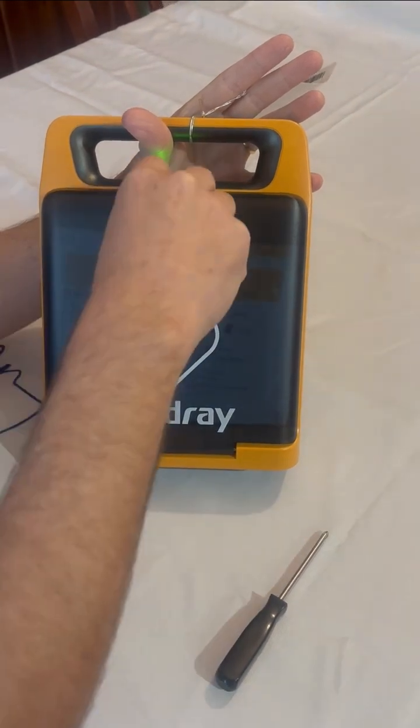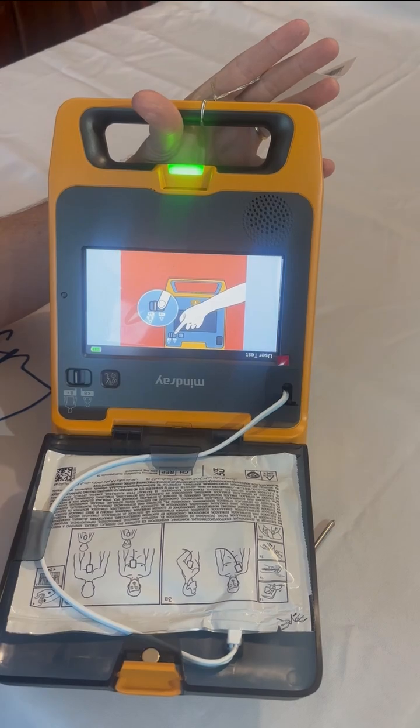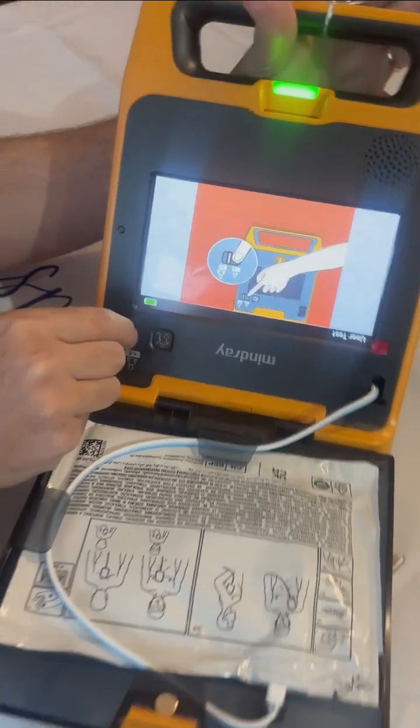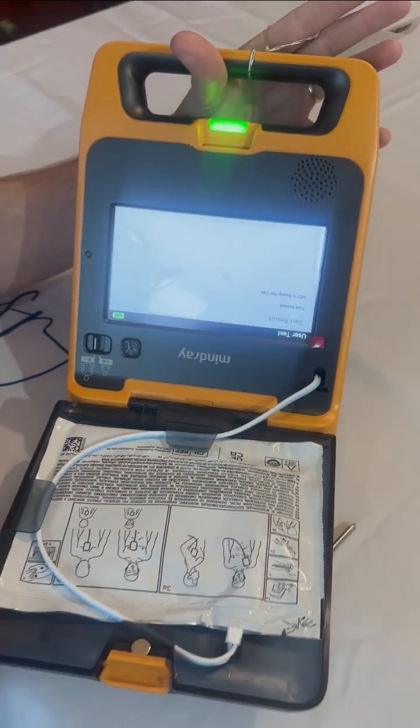Please open the lid and perform control test. Please adjust the adult-child mode switch. First, set to child mode, then back to adult mode. Please press the language button. Test completed. Device OK.